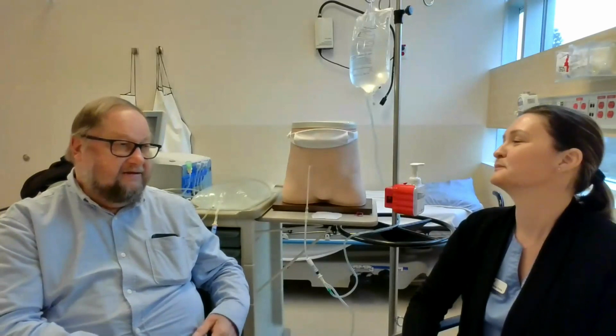I would put the pillow in and cover it with the blanket, and that way, by lying down, it stayed in place so that I could then add the dressing. That's a great idea. It doesn't always look as good as what the nurses and my wife do, but it does work, and it's clean. That's great.